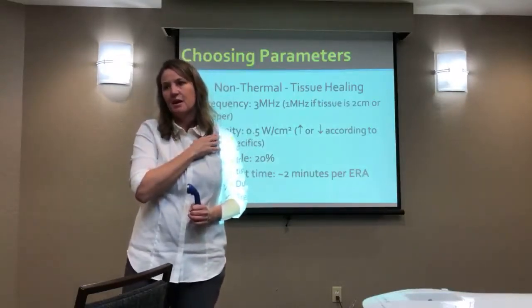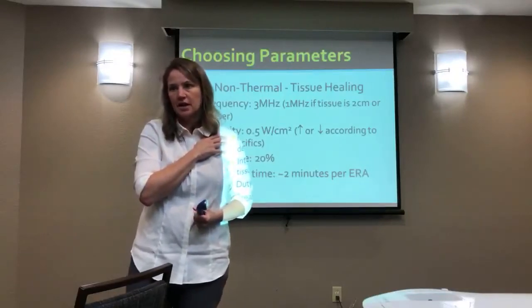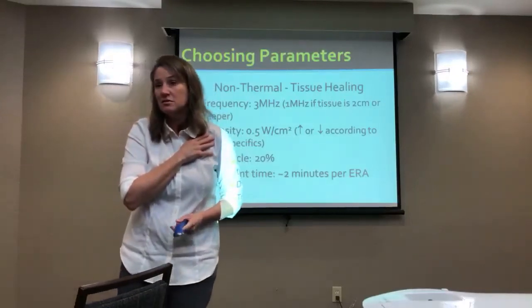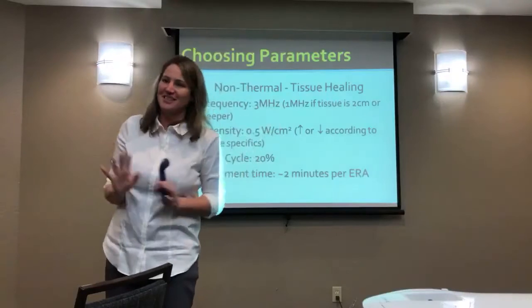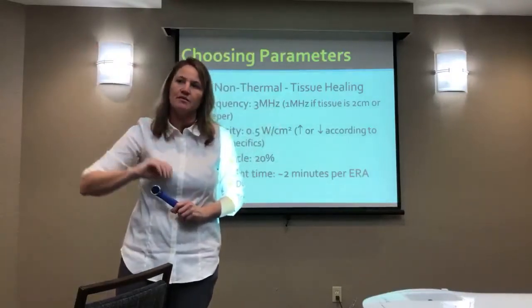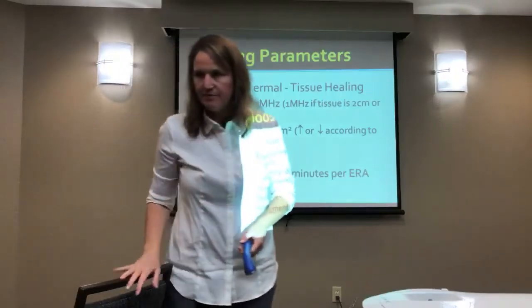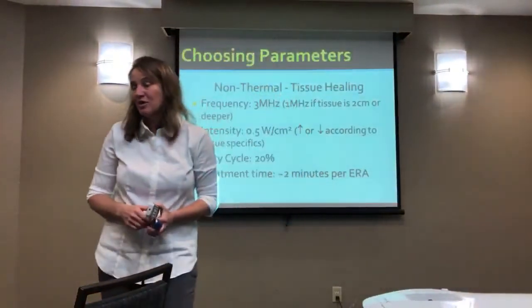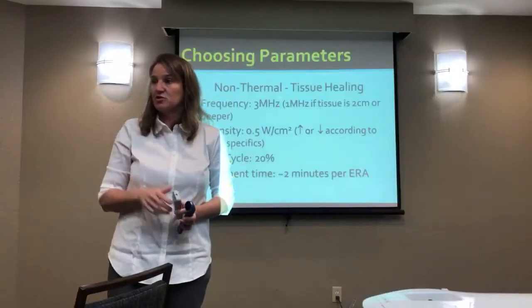What about a muscle strain? A muscle strain, yeah. I mean, again, depending on the shape of the muscle, because we have long skinny muscles, and we have short fan-shaped muscles, you know what I mean? So my trajectory would follow the shape of the muscle tissue. Say rotator cuff. Yeah, and those are linear, but they're small, so I would still be thinking a little bit more on a linear or oval kind of trajectory.